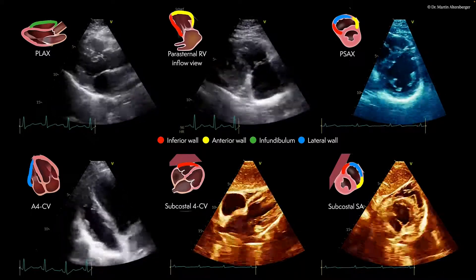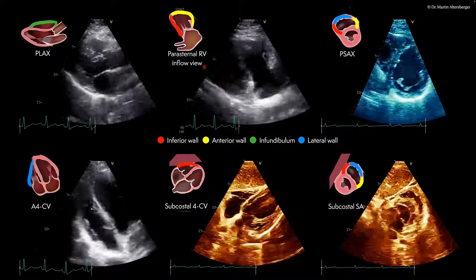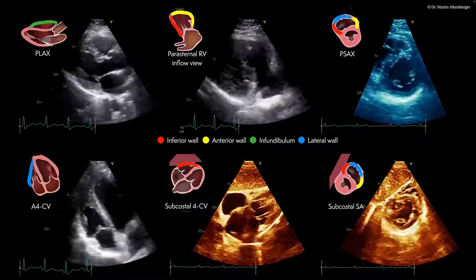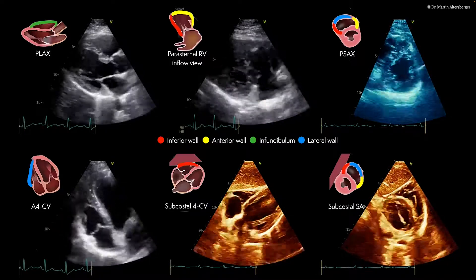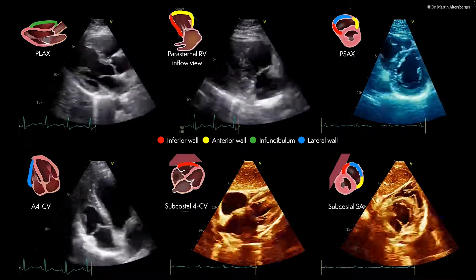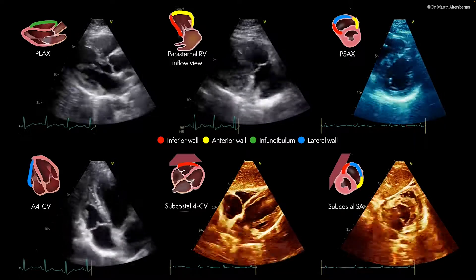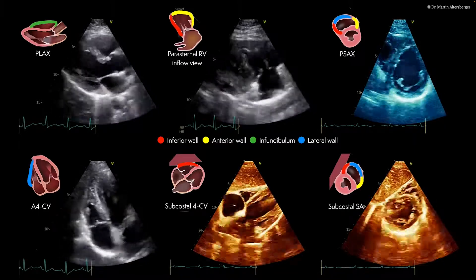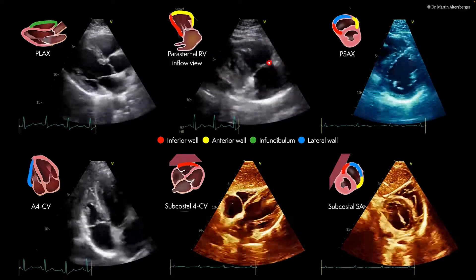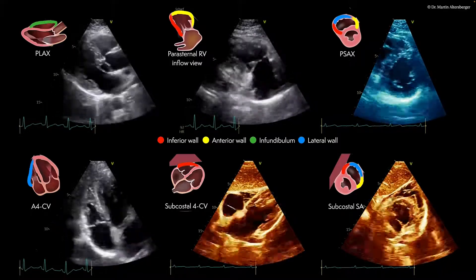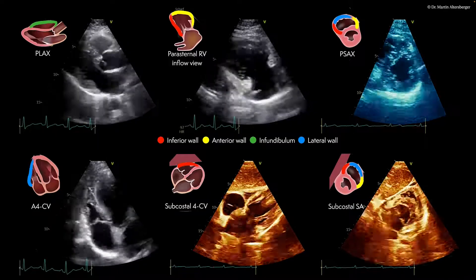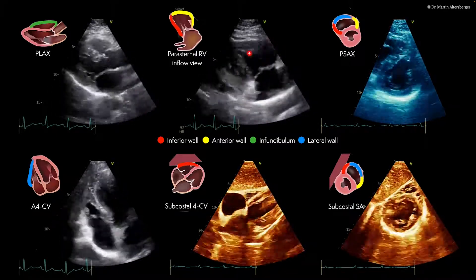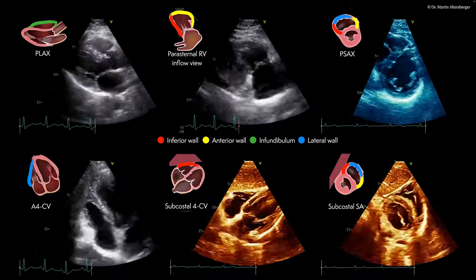If you use a parasternal view of the right ventricle with an inflow view, we have here the right atrium and the right ventricle. You can watch the other videos on the parasternal long axis to see how this view is achieved. You have two more walls you can find and quantify right ventricular function: the anterior wall of the right ventricle and, if you tilt enough, the inferior wall.